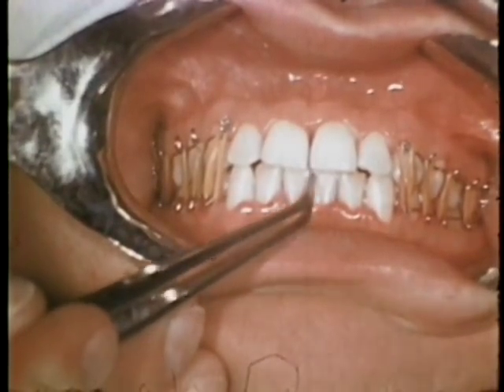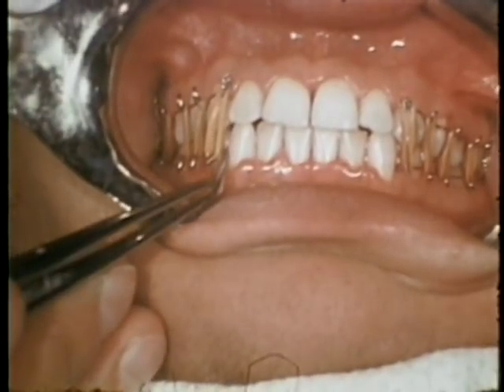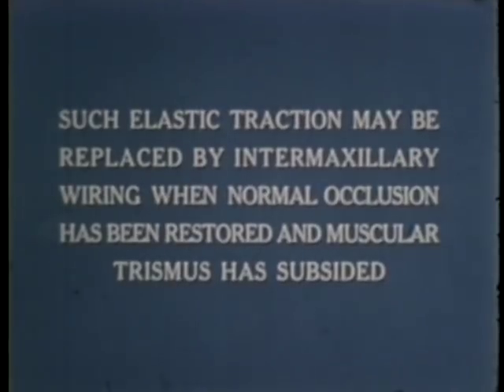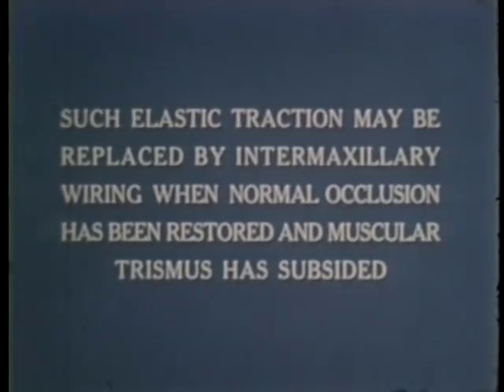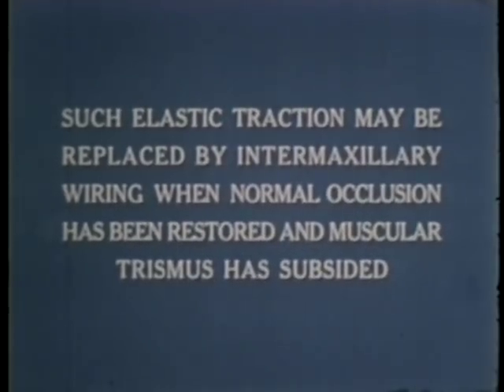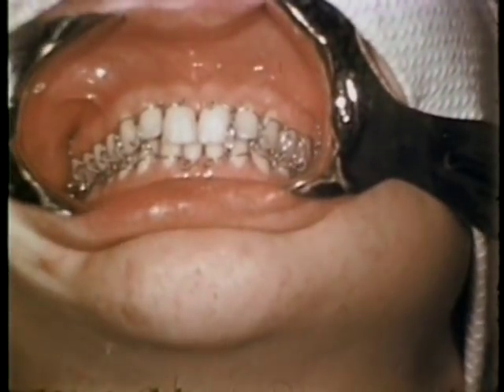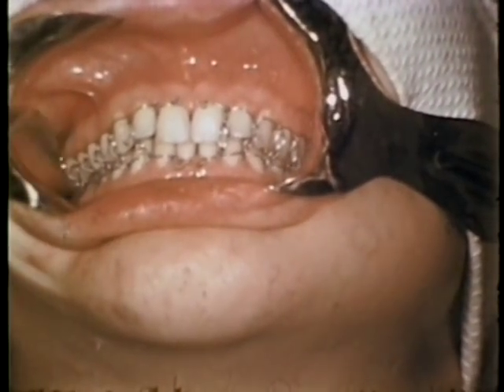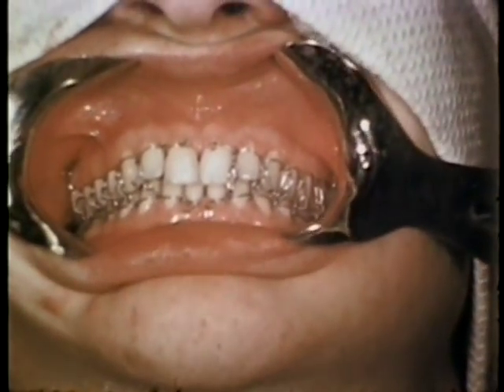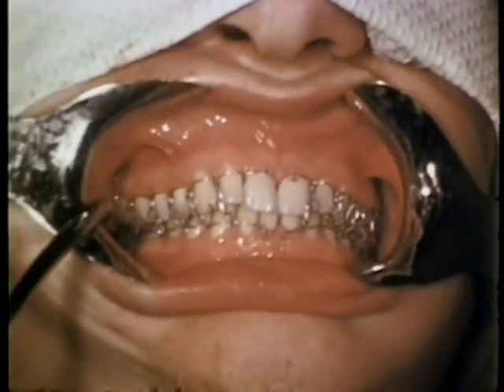The midline is now perfectly aligned and the facets are also in proper relation. Such elastic traction may be replaced by intermaxillary wiring when normal occlusion has been restored and muscular trismus has subsided. In this case, complete quadrants have been incorporated in a single strand of stainless steel wire. Since the loops are small, they may be turned occlusally and the jaws securely immobilized.